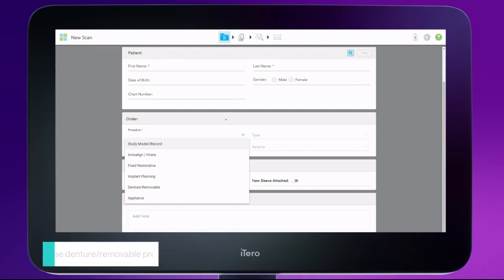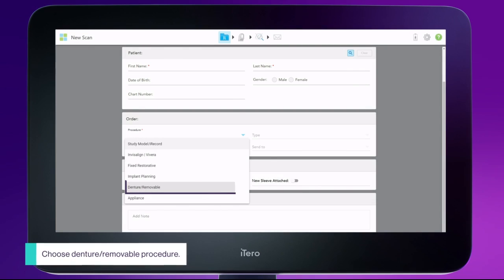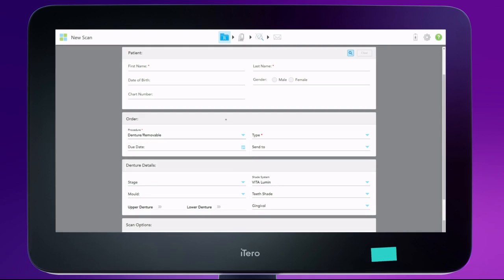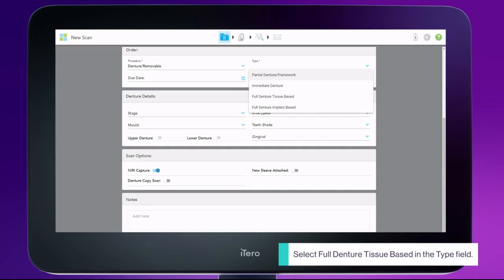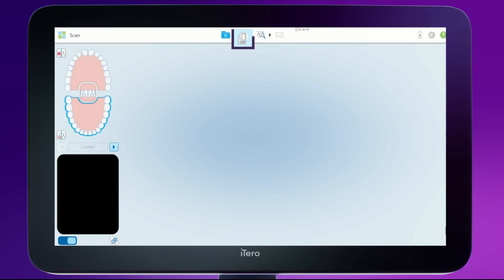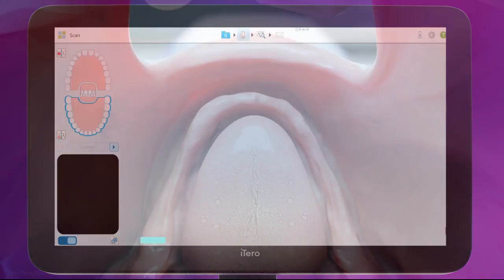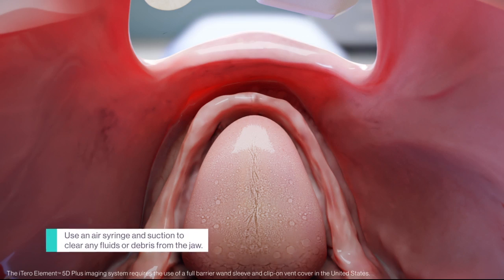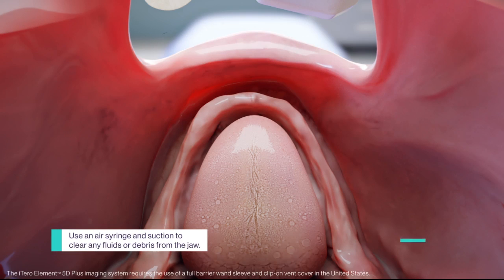Fill out the RX. Tap the scanner sleeve icon to navigate to scan mode. Start scanning the lower jaw — begin with the anterior.